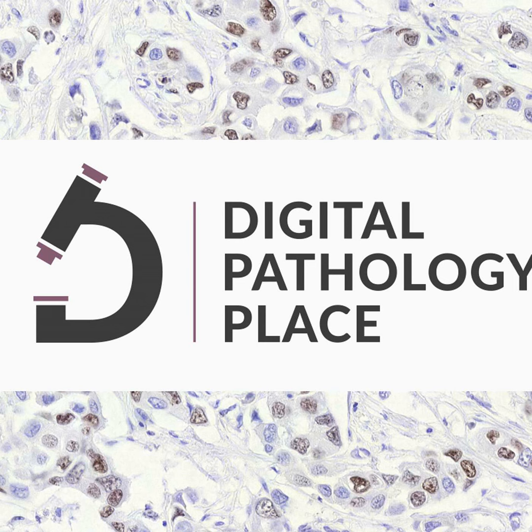And so leveraging central IT solutions, central enterprise imaging solutions, is a tremendous motivator for picking a standard that's already in widespread use. And that applies to annotations too. So, for example, if you're annotating in radiology and you're creating structured reports in annotations for radiology images, it makes sense to do the same thing for gross microscopy and human annotations on slides. So, of course, for deep learning applications where you're creating millions of annotations for nuclei and so on, you will need specialized solutions and specialized viewers and specialized analytic tools, but they can plug into the same central enterprise imaging platform. So the DICOM standard for images, this is done, it's already set, and people can use it.